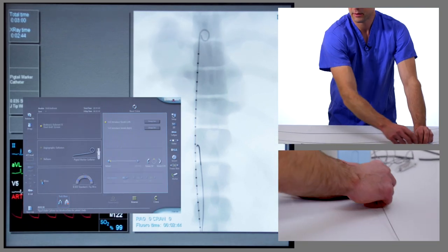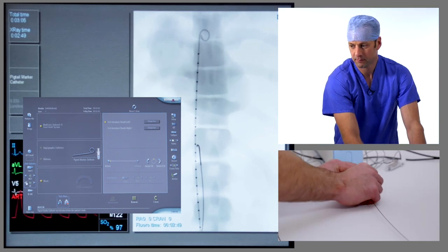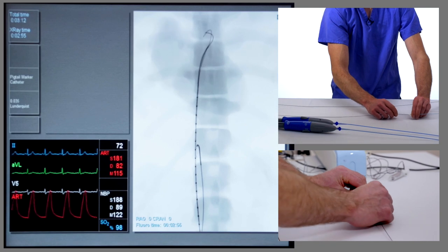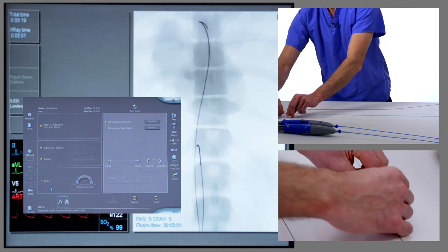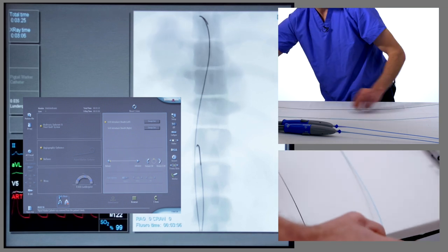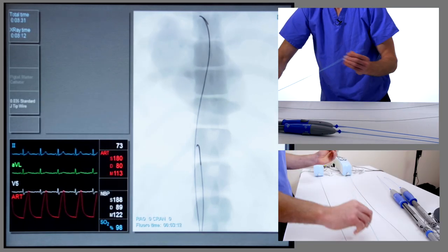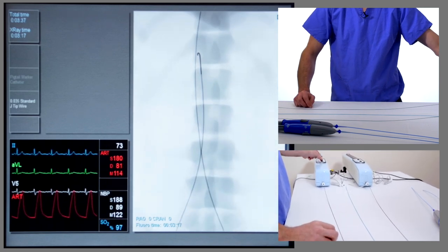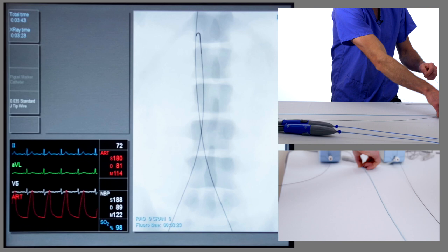We'll remove the J-wire and replace it with a Lunderquist wire, then remove the pigtail catheter leaving the Lunderquist with the tip just in the distal arch. We'll remove that catheter and recentre over the abdominal aorta. We're now going to place a pigtail catheter in the contralateral side, which in this case is the right.